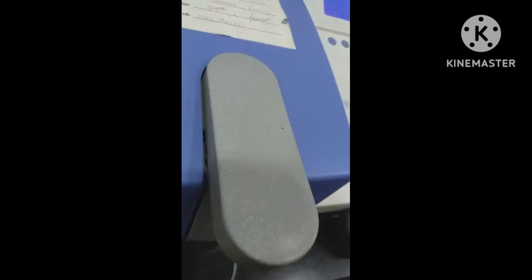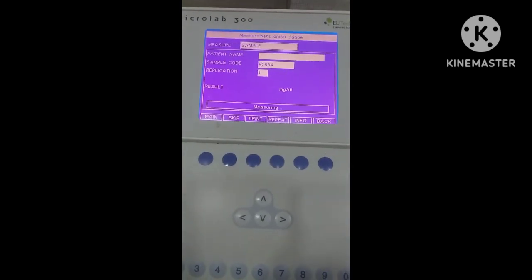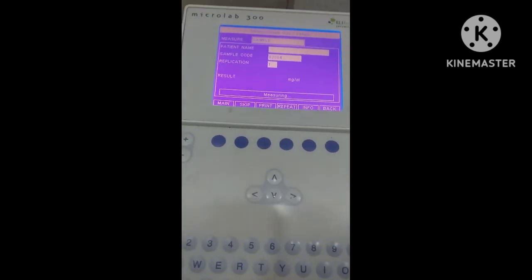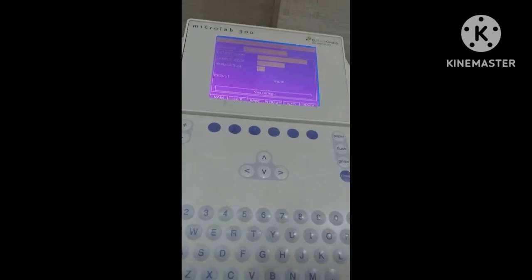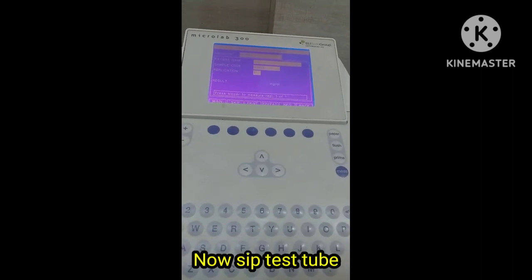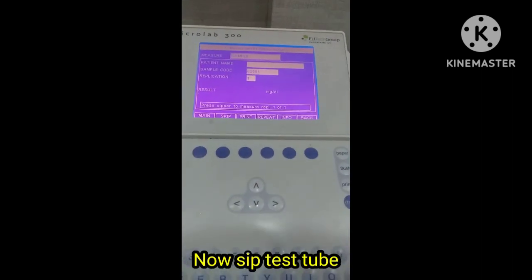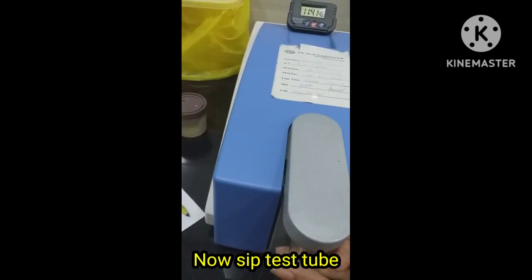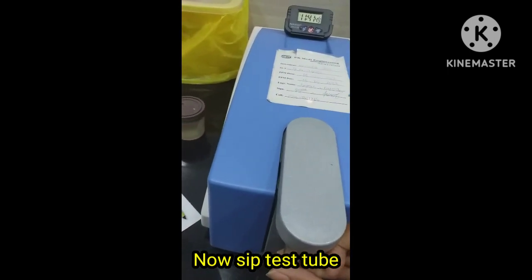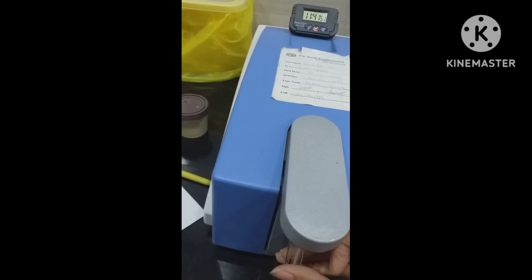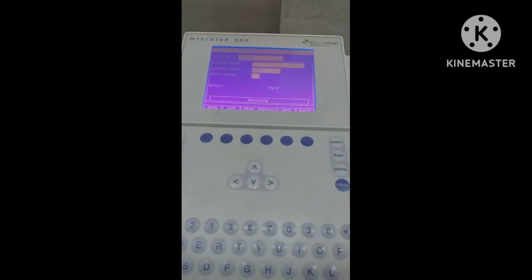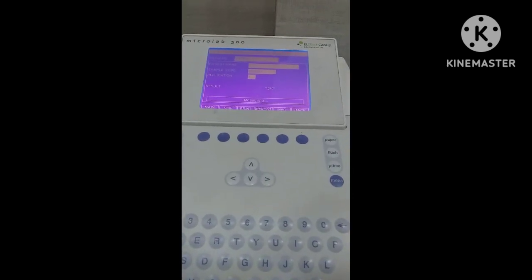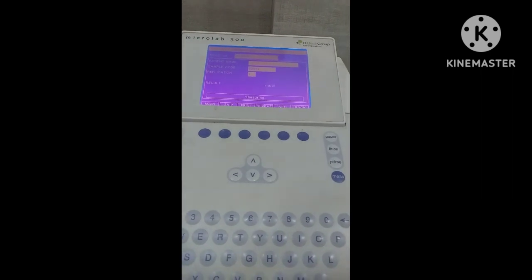The blank tube value will appear on the panel. Then the machine will say to sip the test tube. On the panel it will display 'press sipper to measure test,' so we will sip the test tube. It will take a few minutes to calculate its value, and then the final result will appear on the panel.